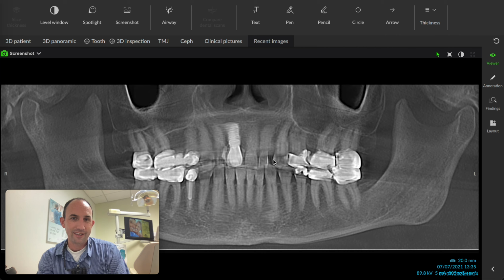I have to be careful how I say that. Screenshot the image so that you can see it on that landing page and they can double click on it and open it, and then your front office can more easily copy and paste it and move it into your other software, whichever you have. Epic or CPS and CDR.